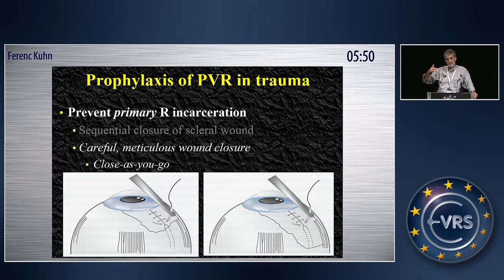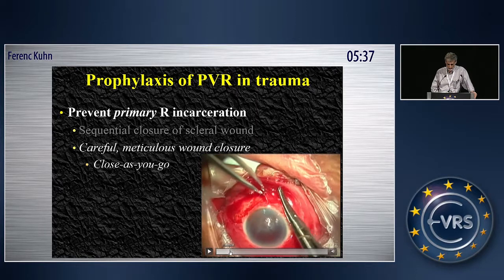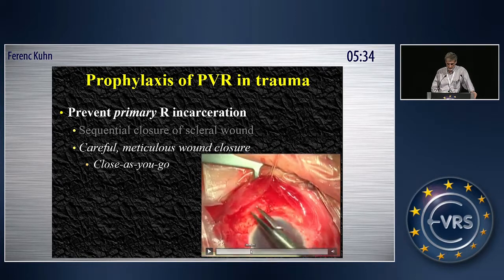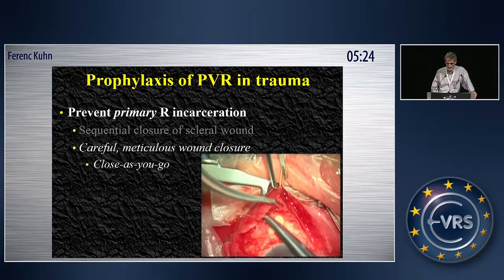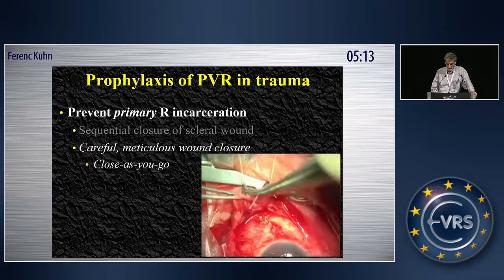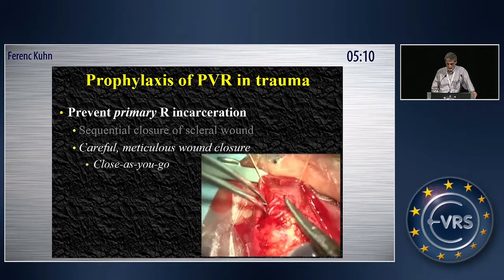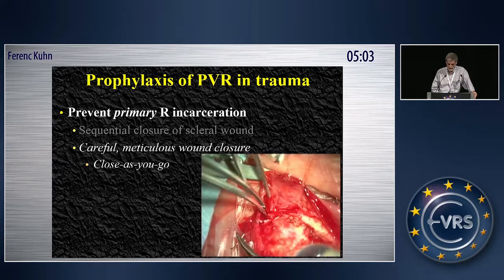As you go closer and closer to the posterior sclera, you have to stop somewhere and not catch tissue because you will cause more incarceration. What you see here is the conjunctiva is opened only anteriorly, and the sclera is closed underneath that area. Further opening of the conjunctiva does not come until the anterior aspect of the scleral wound is closed. So you go step by step more and more posteriorly in a two-step fashion: conjunctiva first, sclera second, conjunctiva again, sclera again.